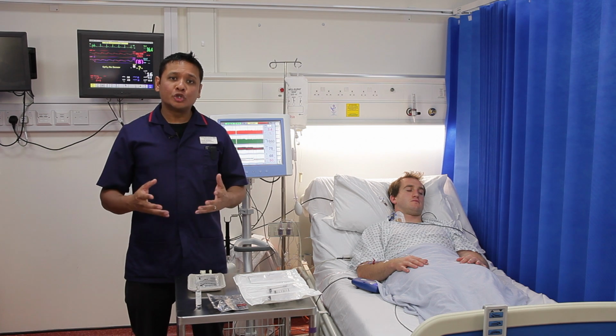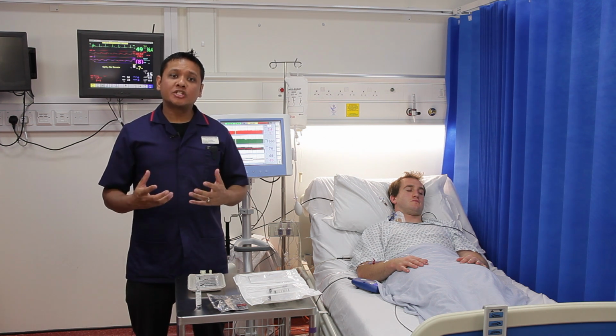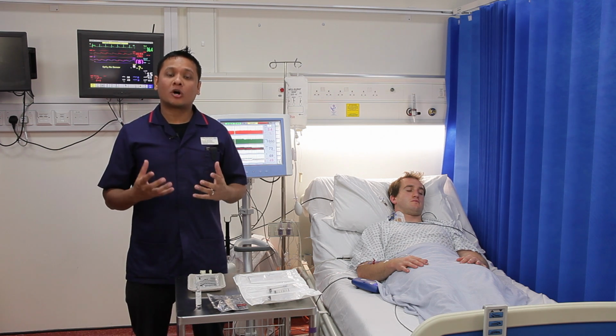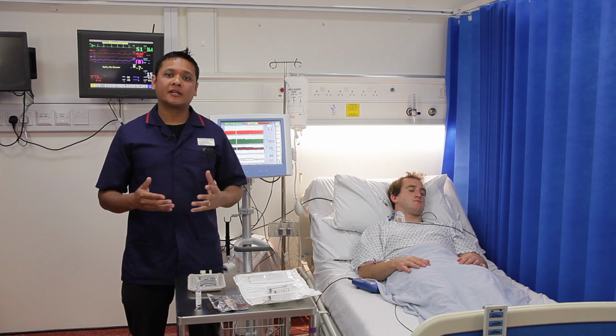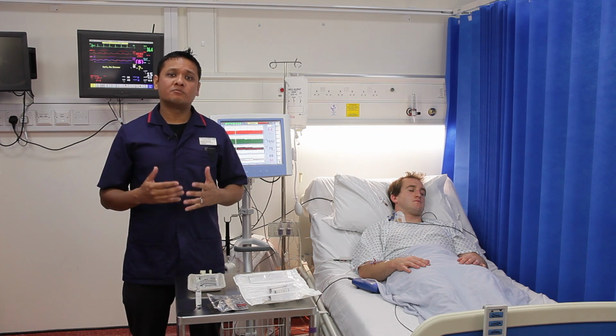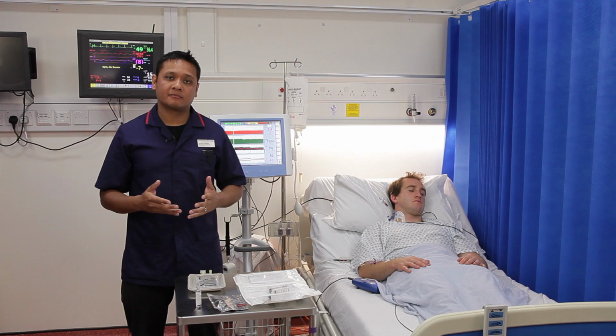If the curve is an unusual shape, perform another calibration. Ensure the injection of the saline flush is quick and smooth and the arterial blood flow is not obstructed. If the peak concentration is too low or too high, the dose of lithium may need to be adjusted. To avoid peak concentration being too low, larger patients may require 0.45 millimoles or a 3 ml dose of lithium. If the peak concentration is too high, reduce the dose to 0.15 millimoles or 1 ml of lithium.